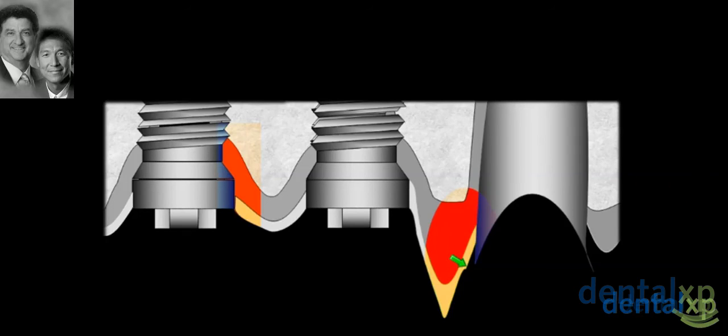And what are we going to have to come up with in order to correct this? We're going to have something on the implant or the implant and abutment that is supracrestal also. If we're going to get a normal papilla between two implants, just keeping 3 millimeters apart, as you see in this diagram, is not going to be enough. Notice the bone level is the same on both. But what's missing? Supracrestal biologic width, supracrestal fibers and attachment. Got it? I say it again and again because we must focus on that. That's going to be the answer.